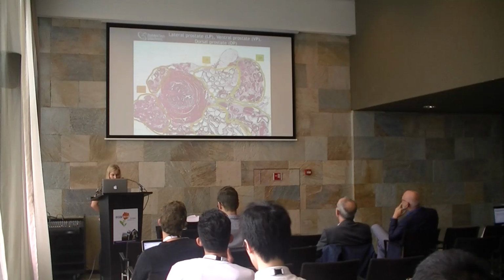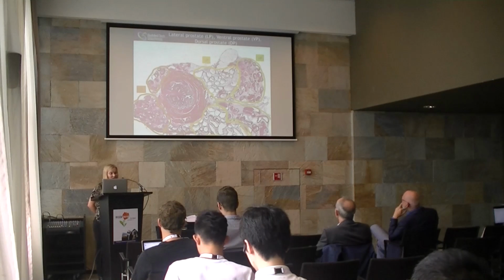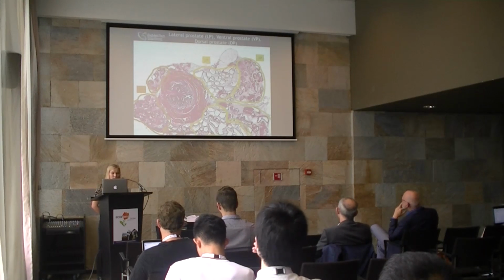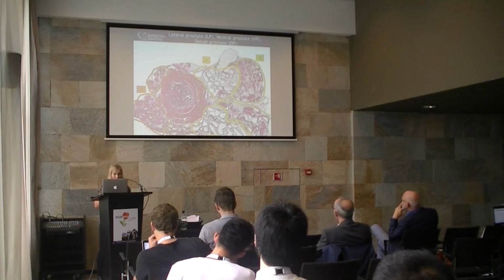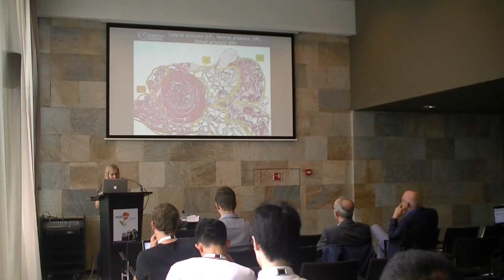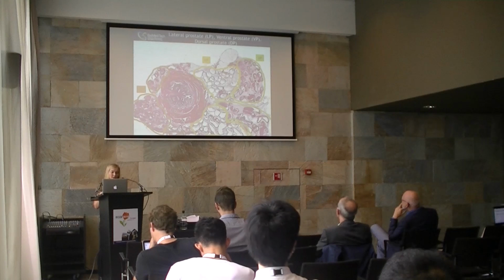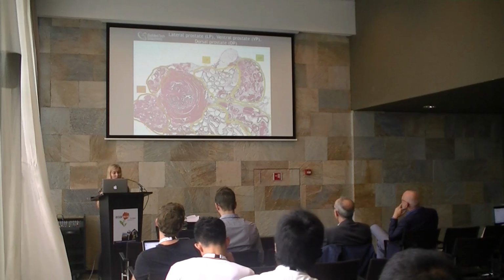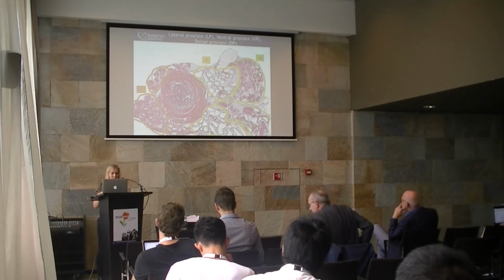So let's look more closely at the different sides of the tissue: lateral, ventral, and dorsal. For example, if you look at this lateral prostate, it would be quite easy to detect this epithelial cell growth, as the epithelial cells are arranged in this really thin row. However, when you look at, for example, this dorsal prostate, the epithelial cells are already growing quite thick inside the lumen. So to detect these early changes from all these different sides, we analyzed this expert segmented dataset.